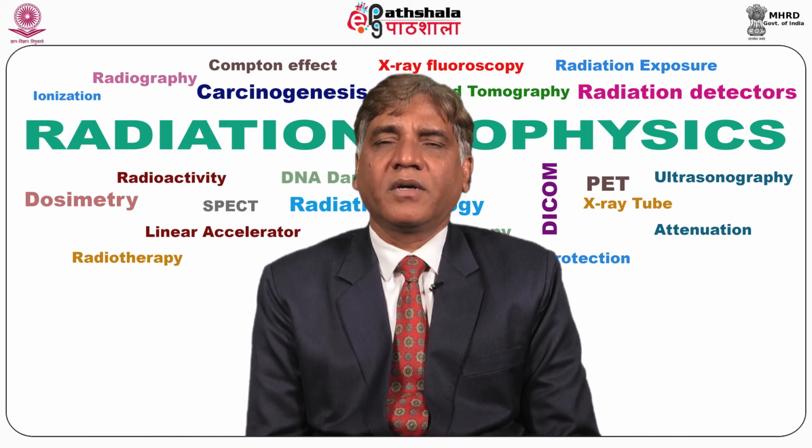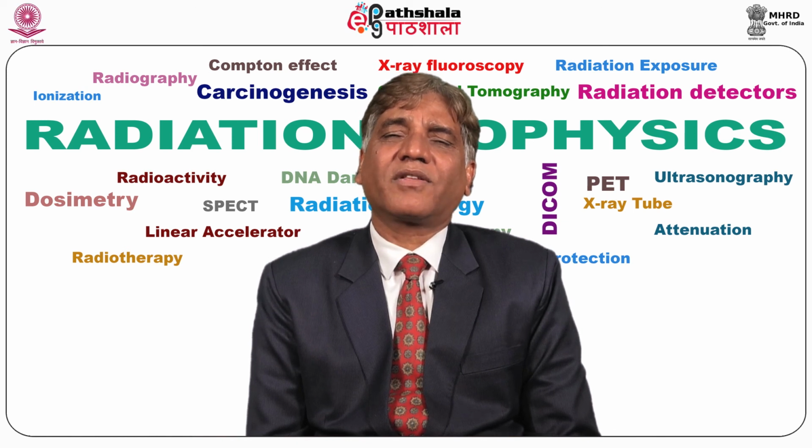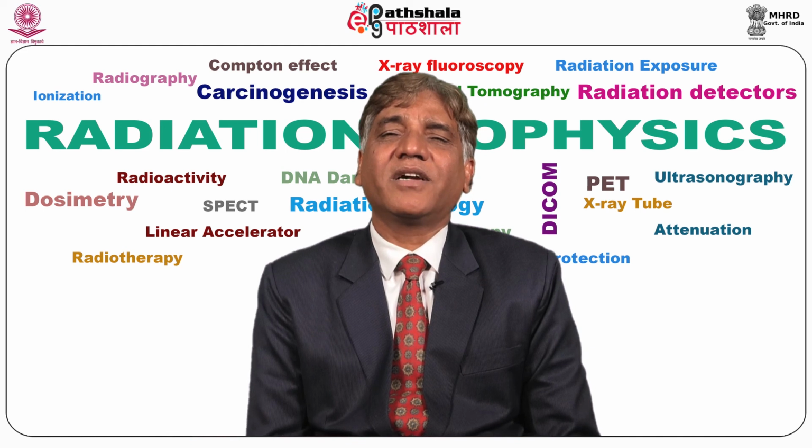The Doppler scanner uses the Doppler principle, wherein the frequency of the sound wave is perceived to be different from the transmitted wave because of the motion of the structure. For example, this Doppler is useful in detecting blood flow. Blood is moving.